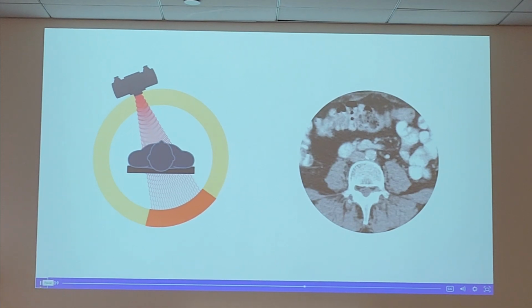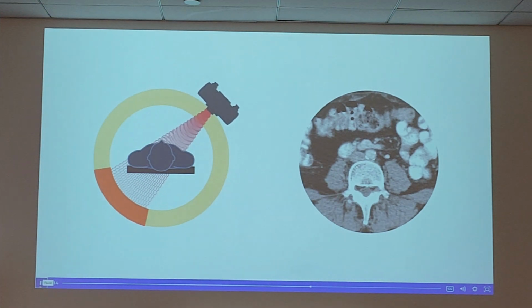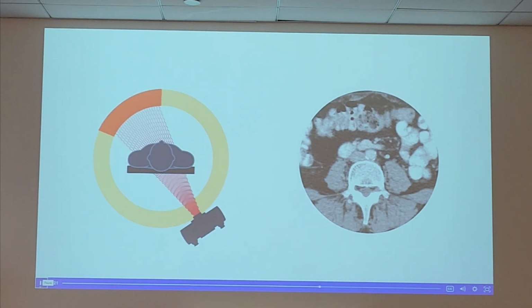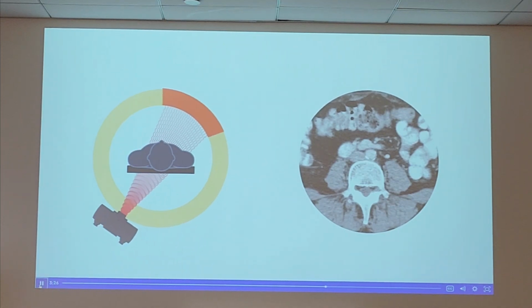Just like general radiography, CT scanners detect and display tissues based on their density. Tissue differentiation in CT is entirely dependent on the tissue density, which is why we often inject contrast to make sure that we can see certain structures. What is tissue density? It's like bone versus soft tissue, just the attenuation that we were talking about.